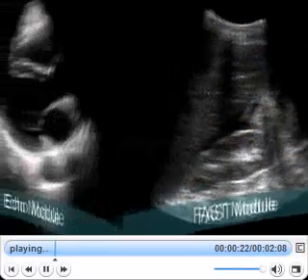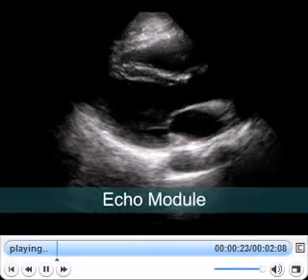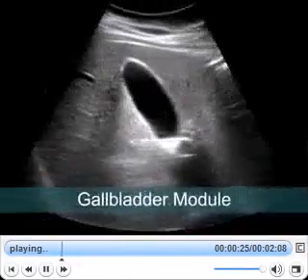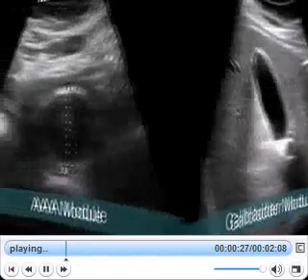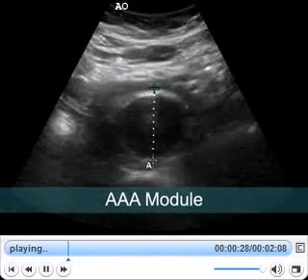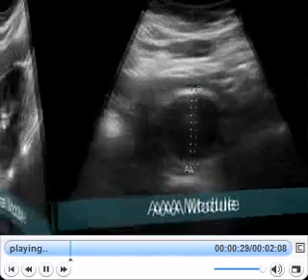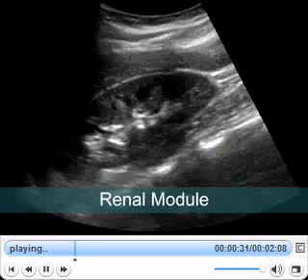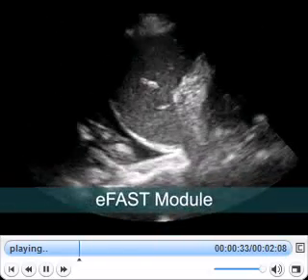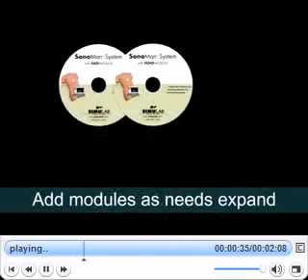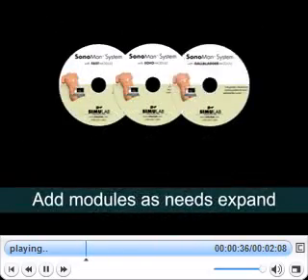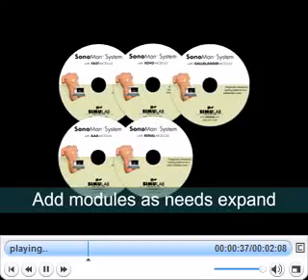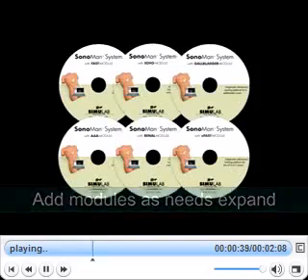Exam modules include FAST, ECHO, Gallbladder, AAA, Renal, and EFAST. You have the flexibility with Sonoman to add modules as your training needs expand.